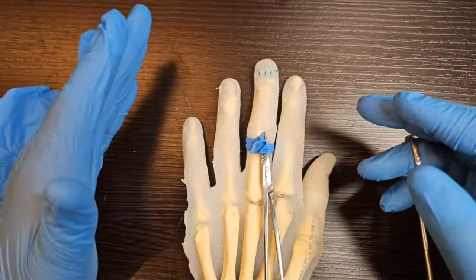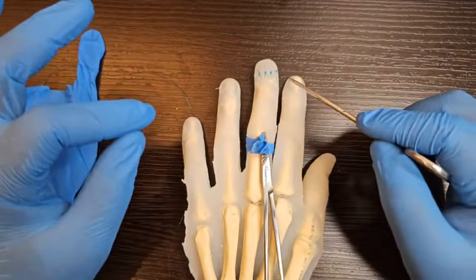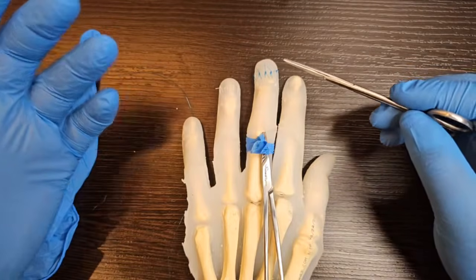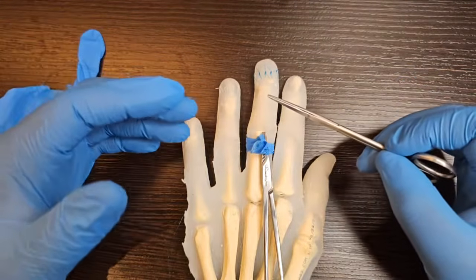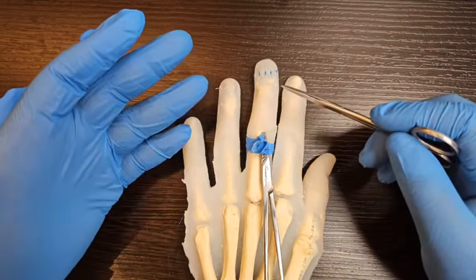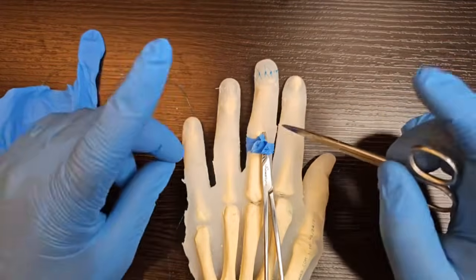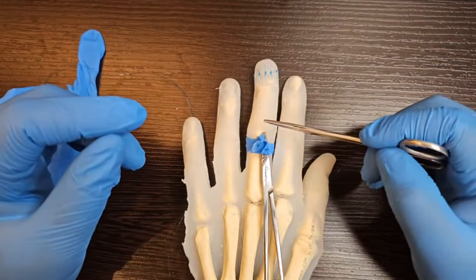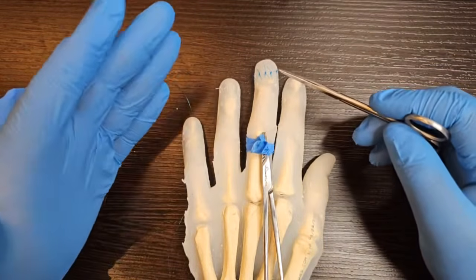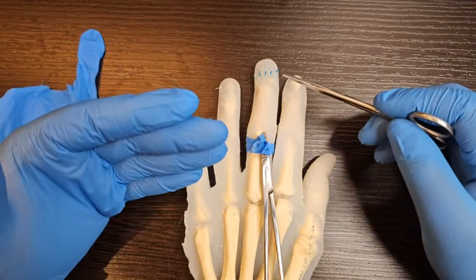You need to note the tourniquet time. I give myself about 12 minutes to do a simple nail bed and 21 minutes to do a complex nail bed. Why? Don't know, but that's how it works, and it works very well for me. It's a reasonably quick procedure, but don't rush. Fingers haven't got any muscle in them, so they are ischemia tolerant, but it shouldn't take you more than half an hour, really. A simple nail bed, I think, should be done within 20 minutes, but you need to have a plan before you start.